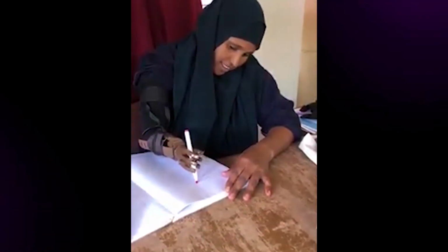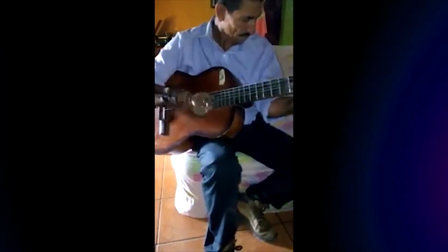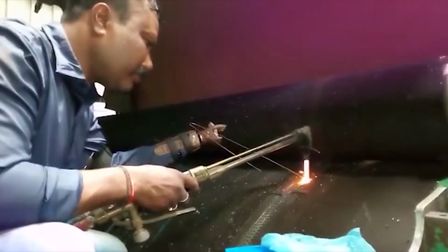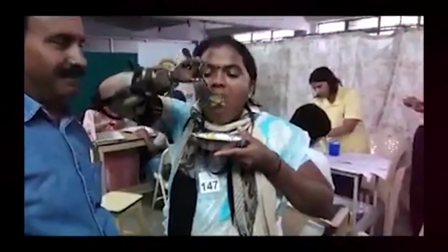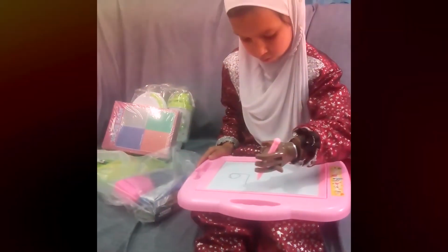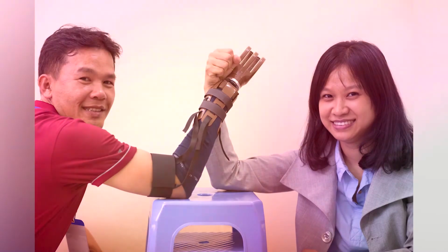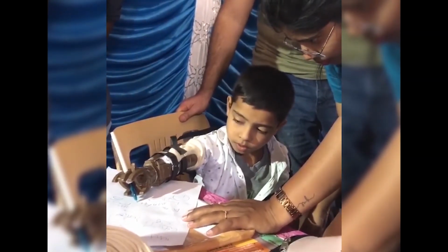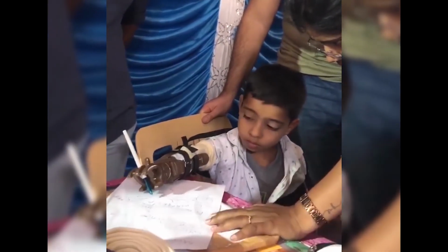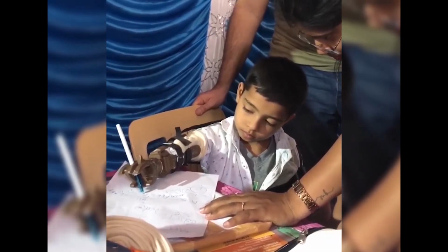So earlier, I had shown you the toothbrush, right? With my non-dominant hand, I am not as proficient using the toothbrush as I would be with my dominant hand. Similarly, if I were to wash dishes or wash a car or wash windows, I have a little bit of a difficult time holding it and using it, especially if I don't have another hand to help me brace up against it. And then finally, I dropped my ink pen. One moment, please. The biggest and most profound thing, if a person has lost their dominant hand, is being able to write. While sometimes we are able to learn how to write with our non-dominant hand, we are never as proficient as we were when we had our dominant hand available to us.